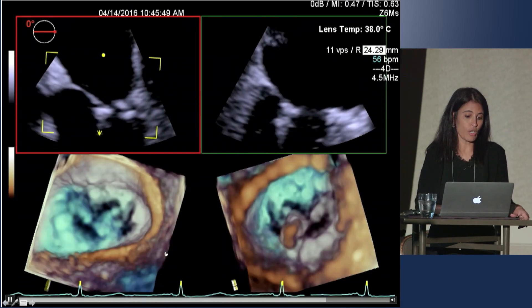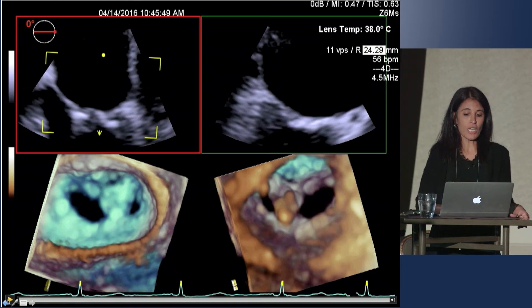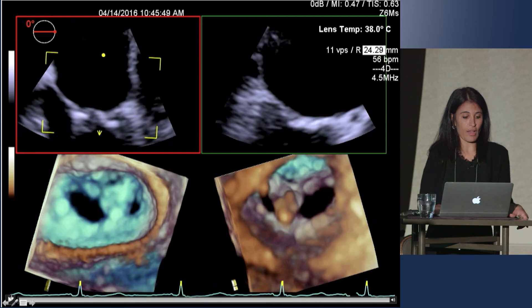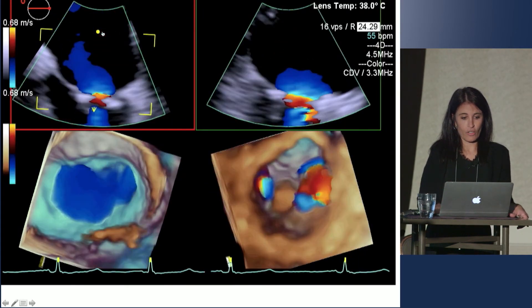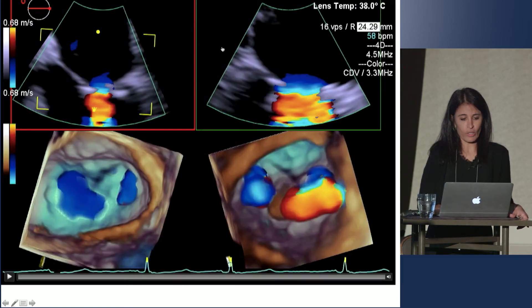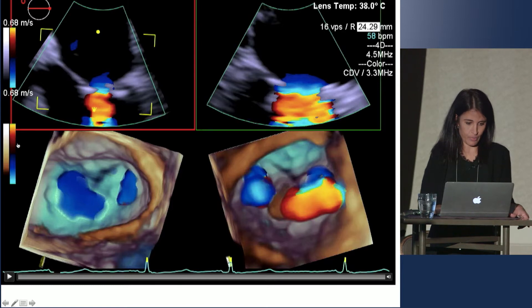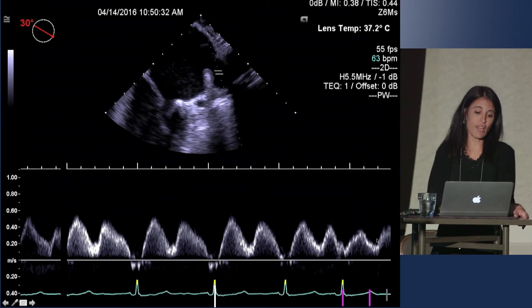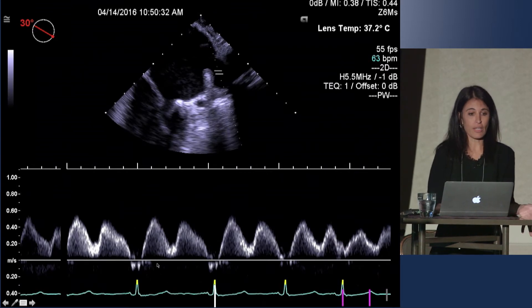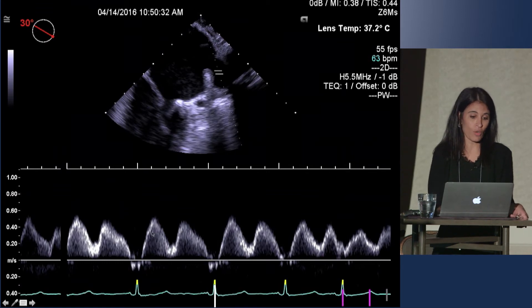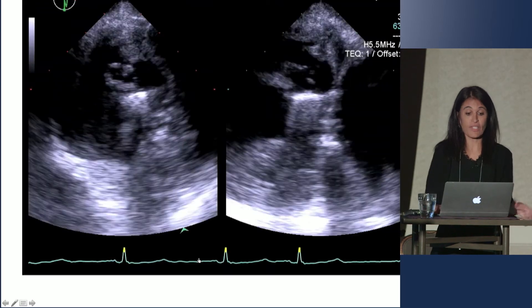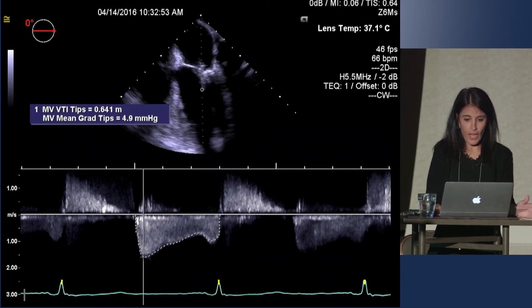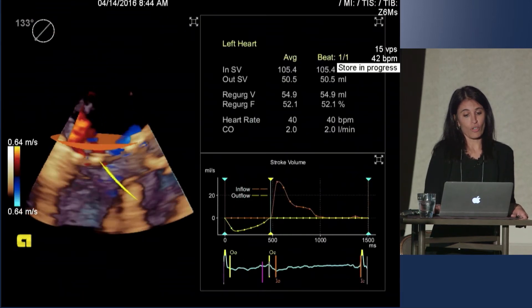Looking at it by 2D and 3D, we know we have a dual orifice — we went a little bit more medial. Looking at real-time color flow on top of the clip, you can see that your mitral valve regurgitation is significantly reduced, and on the LV side you don't really have the flow convergence that you saw prior to clip. Semi-quantitatively, the patient had flow reversal pre-clip, and now you can see with the semi-quantitative metric there is return of normal pulmonary vein flow configuration — another metric that helps us feel good about the MR in this patient. The gradient is only about five.